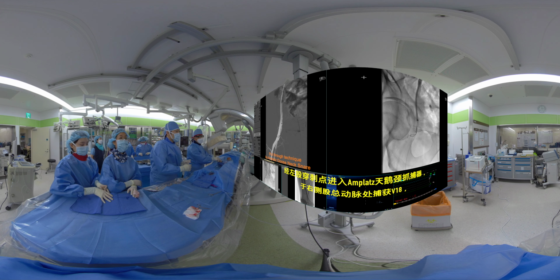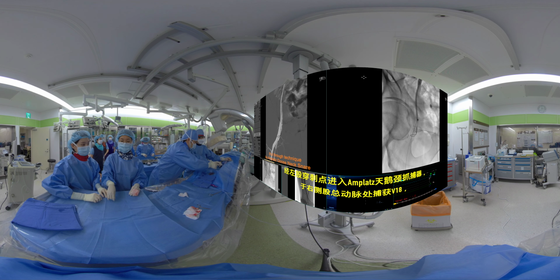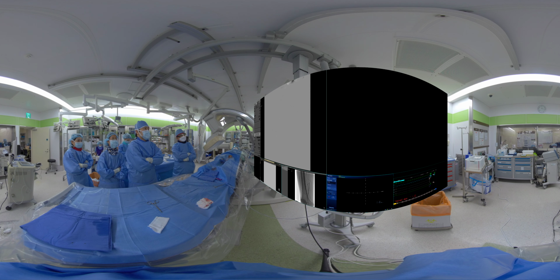The V18 wire was captured in the right common femoral artery with a 10 mm Amplatz Goose Neck snare, and re-entry was finally completed.